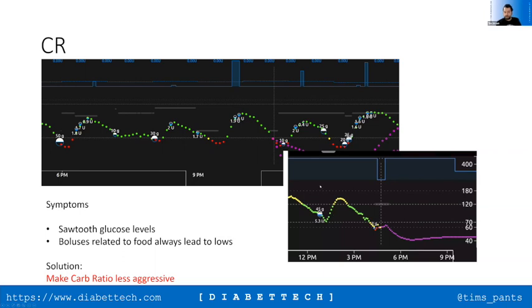And these are just some of the patterns that you can start to see in this case. But it's not always obvious. That's the key thing here. Sometimes these things aren't as obvious, and we've tried to pick more obvious examples here where we know what the cause is and what's going on. Presumably, you need to be quite confident that you're carb counting accurately before you do anything about that. Yes, but you can test it, right? So you can do an accurate carb count test to find out whether it's right.